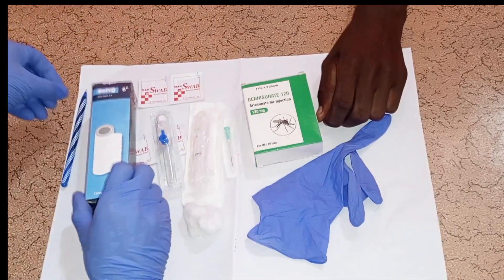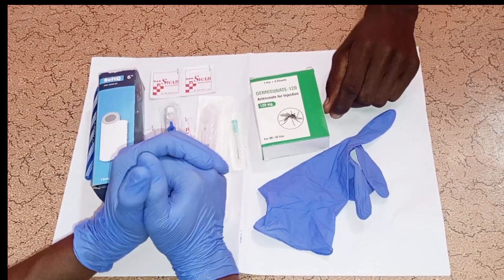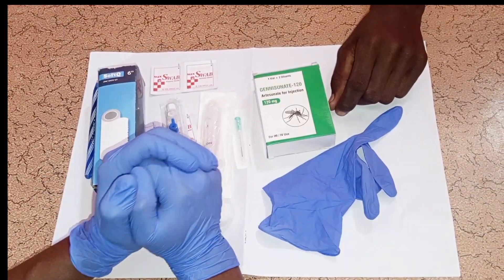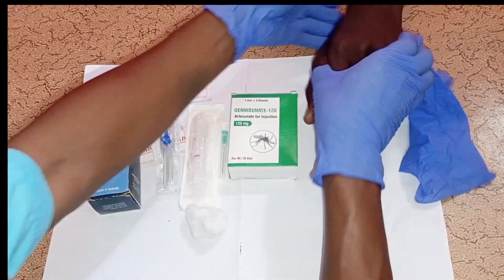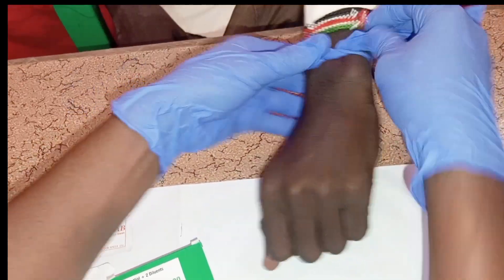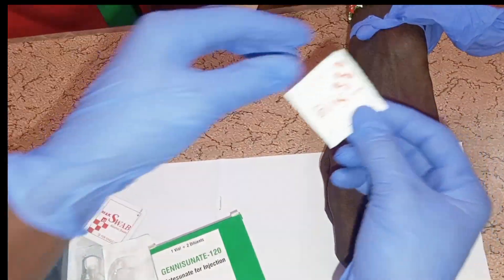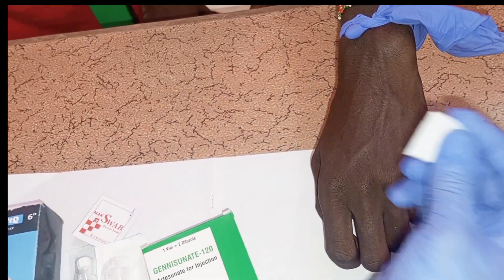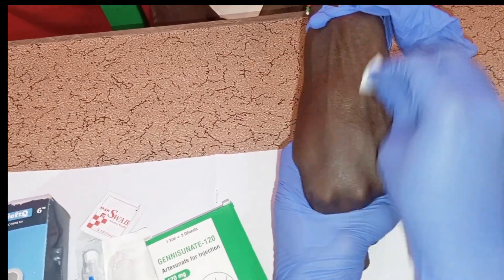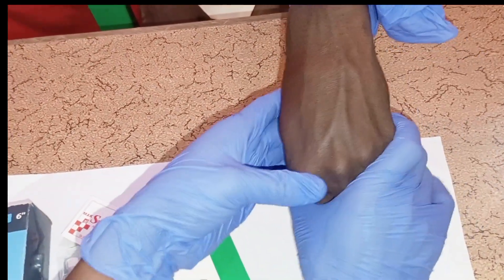You will also need adhesive plaster to secure and dress the cannula. Start by introducing yourself to the patient and gaining consent. Then apply a tourniquet first to perform IV cannulation. Get an alcohol swab, clean the vein before inserting the cannula, then allow the skin to dry.